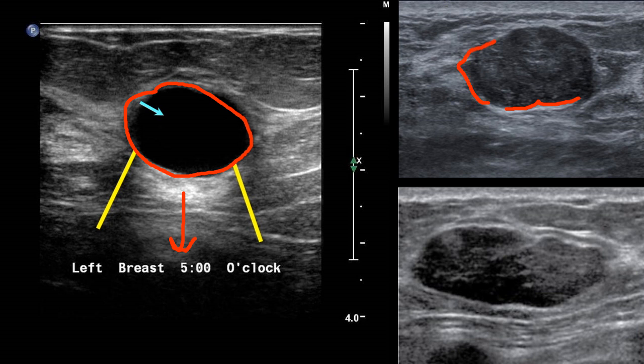So I can't really tell what's going on in that area. Is it angular, meaning it's a little bit box-like in its shape? Does it have a jagged extension that's trying to come out from it? I don't really know, so I can't call that perfectly oval.